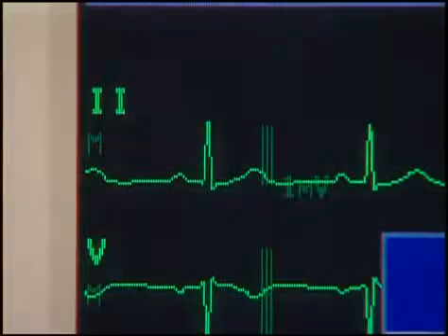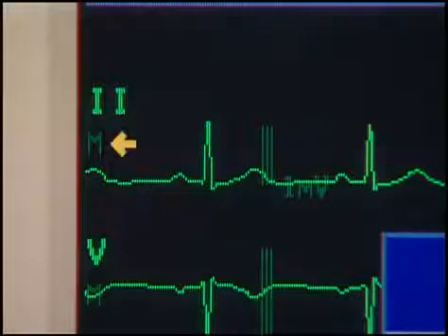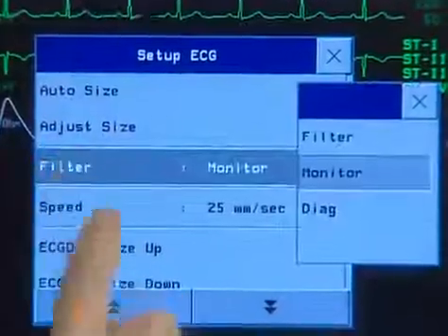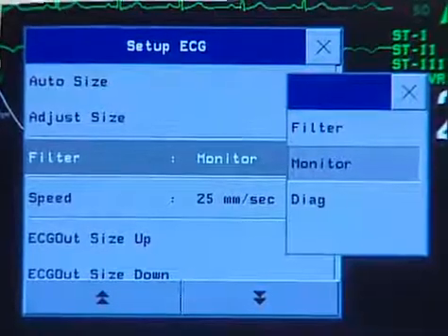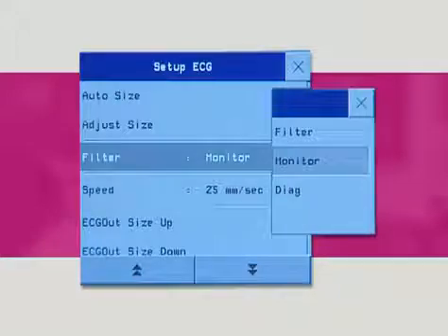The ECG filter setting defines how ECG waves are smoothed. A letter indicating the filter type appears beneath the lead label on the monitor display. To change the filter setting, select filter and then select the desired setting. The filter setting is often used in the OR to remove electrocautery interference.